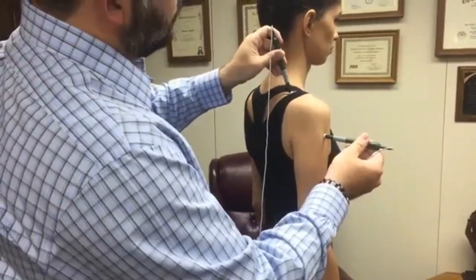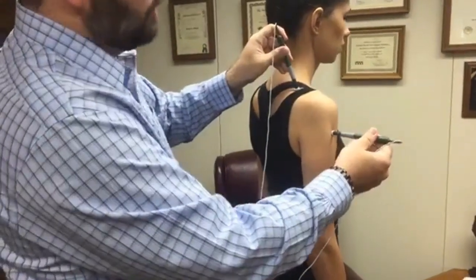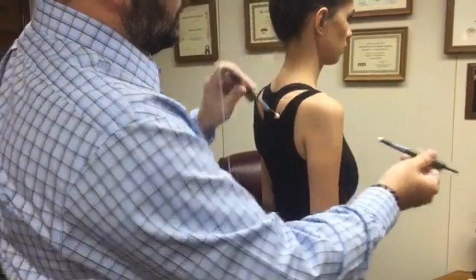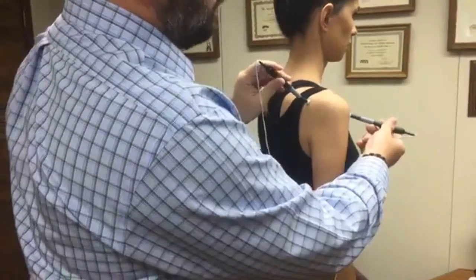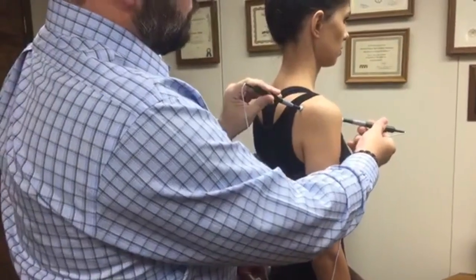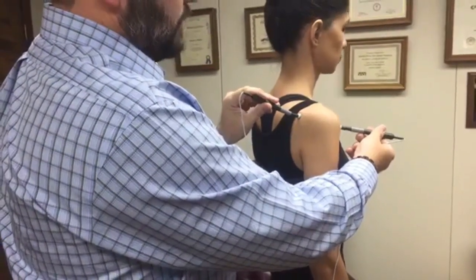Just a few angles. Do you feel anything, Rachel, as we're doing this? No, I think I'm okay. So it's subsensory — you really don't feel much as you treat. Current's passing through, and every now and then if you're right on a nerve involved with the pain, they may get a little prickly sensation. But for the most part, as you're treating extremities, the patient really won't experience much. So that's our small star.